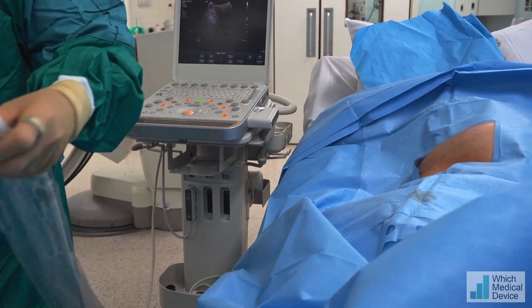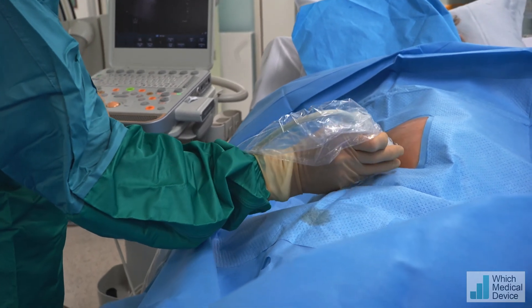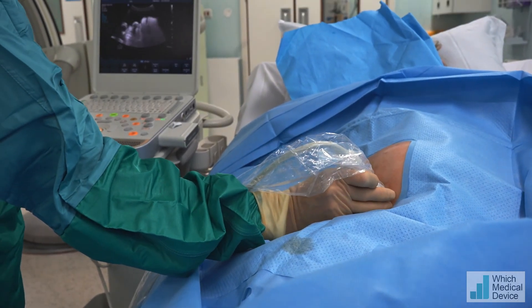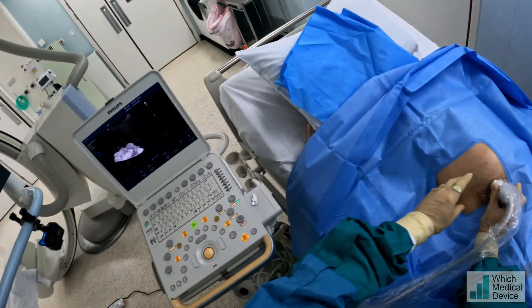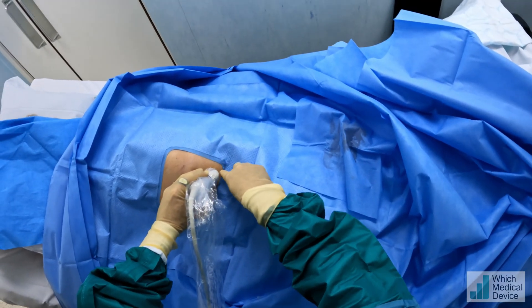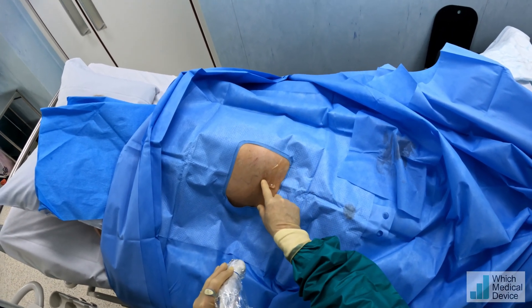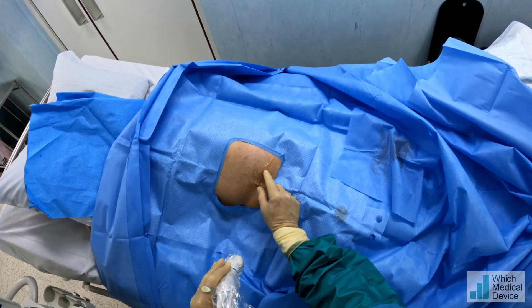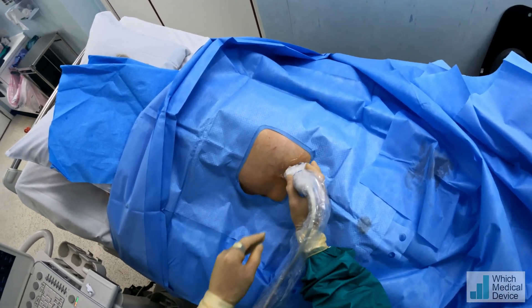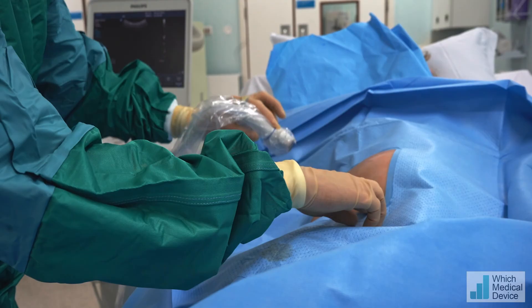We'll have a look with the ultrasound and plan where we're going to place this Pleurex drain. This will be cold on your tummy. You can see a lot of ascites, particularly down into the pelvis. The actual skin puncture site is going to be here, aiming into the pelvis, and the Pleurex drain will come under the skin and come out here — exactly like a tunneled Hickman line — with a cuff about halfway along it to fix it into place. I'm happy with that; that's where our puncture is going to be.